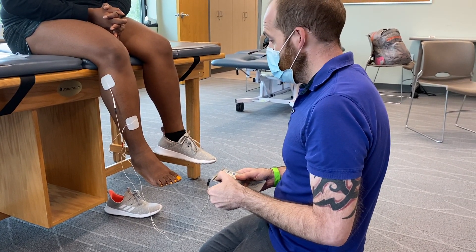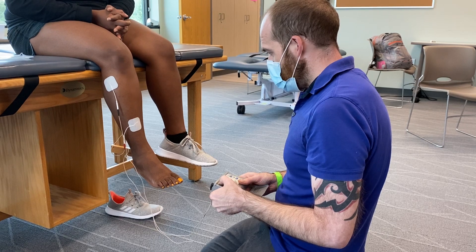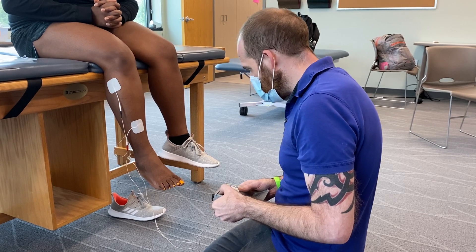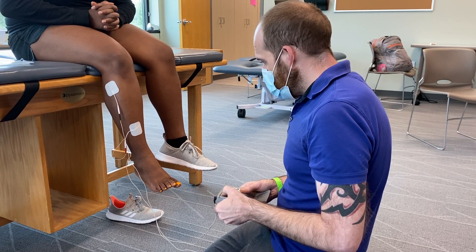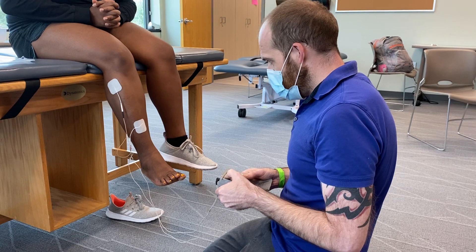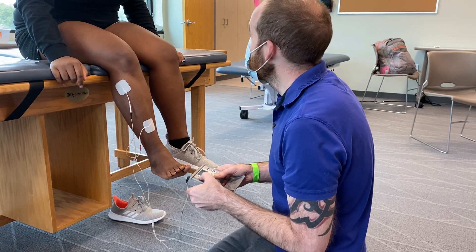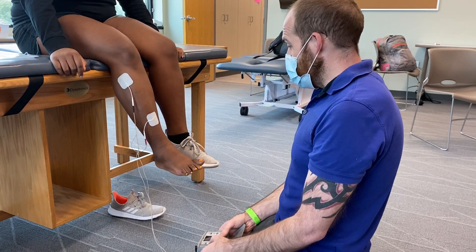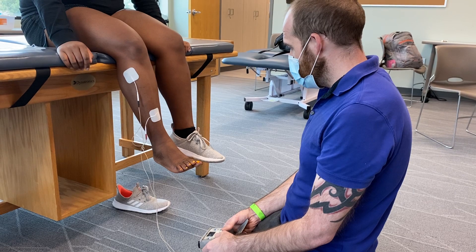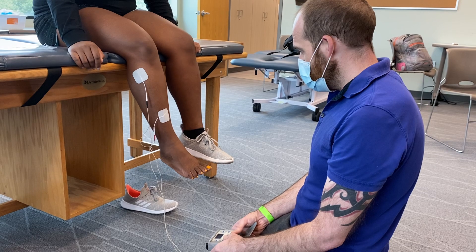Okay, this is usually about where you start to feel it. There go the toes. Is it painful? No — we're higher now. It's doing its own thing. Good. Not painful, just weird. Now let it go. As you can see, it dorsiflexed. Is it on right now? Yes, and then it's going to go off.